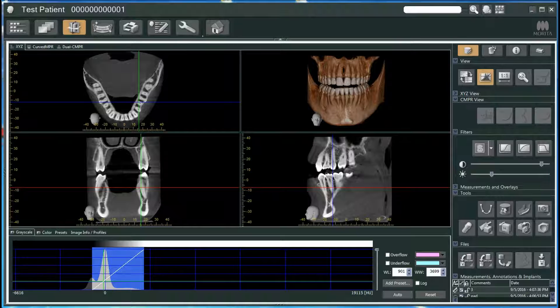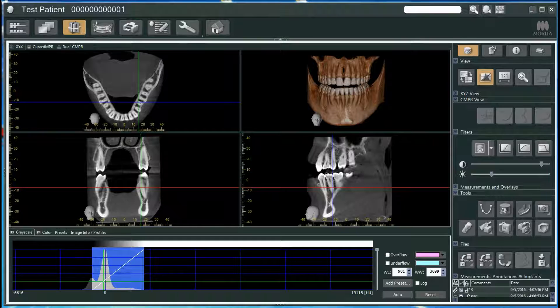Hi everybody, this is Dr. Esteban Velez, and I'm going to be going over a little demo and tutorial of the Jaymorita iDixel CBCT viewing software. This is software that comes with all of their CBCT units. I currently own a Jaymorita R100 CBCT unit here in the office. I've been using the viewing software for all of my viewing needs, and I use BlueSkyPlan for all of my implant planning and 3D printing of my surgical guides. Between the two, using this and BlueSkyPlan has been a fantastic marriage of the two softwares, and they both get done exactly what I need.